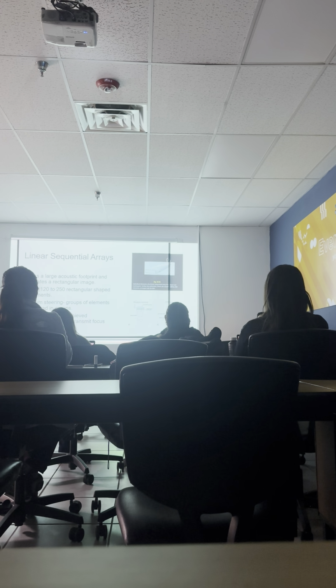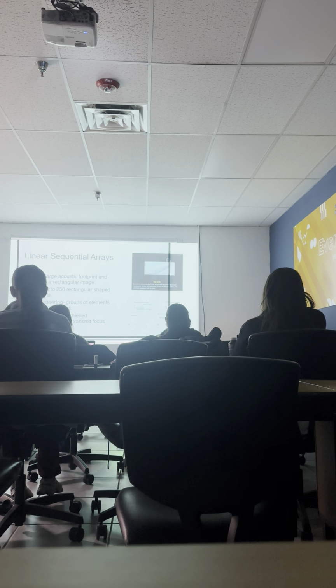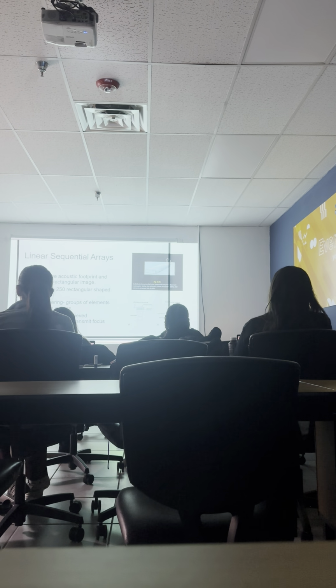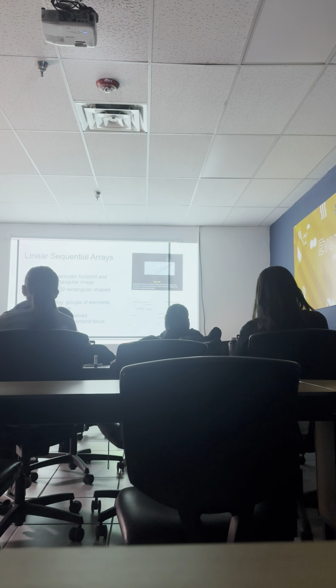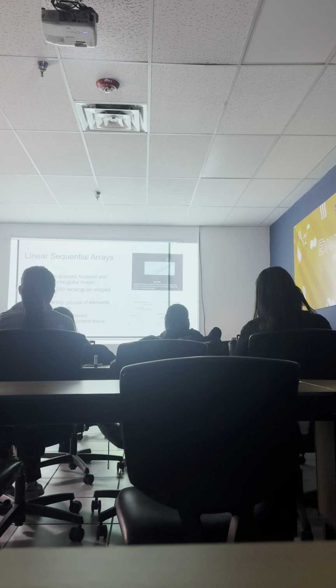Why do we have a bandwidth? What makes a bandwidth? The different types of... the backing layer, okay? So there's a bandwidth because of the backing layer. Okay, but that backing layer isn't just there; the machine can tell it how sensitive to be.